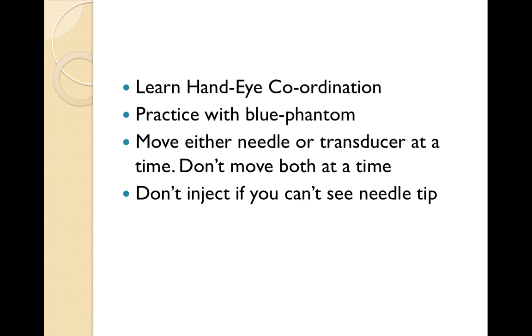After learning all this, the important thing is we have to learn hand-eye coordination. When you are giving an ultrasound guided block, your eye is on the screen and you are maneuvering the needle on the patient's body. So you need to learn hand-eye coordination like a laparoscopic surgeon does in laparoscopic surgery. We can practice with a blue phantom, or you can prepare your own blue phantom very cheaply with paneer easily. We have to move either the needle or the transducer at a time.